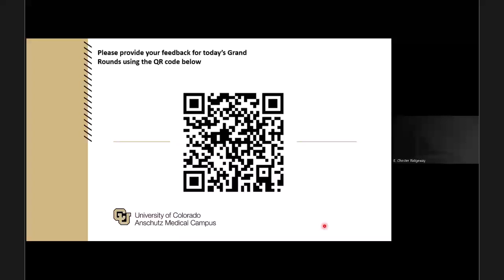And then for the final question for today, I'll take it. So I've noticed, maybe it's been there forever and I was oblivious, maybe this is fairly new, but for chest x-ray reads, there's a clear read. And I don't know what that is. Excuse me, not the reads, but on the images. There's some sort of computer-generated clear read. I don't know what that is. Is that something that is helpful that we should be looking at? Is that something that we don't need to worry about at all?